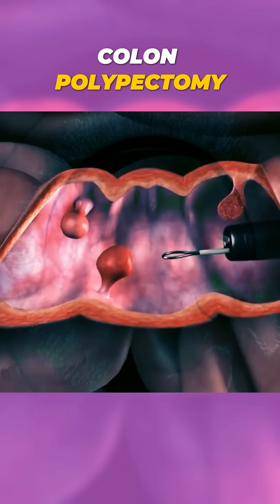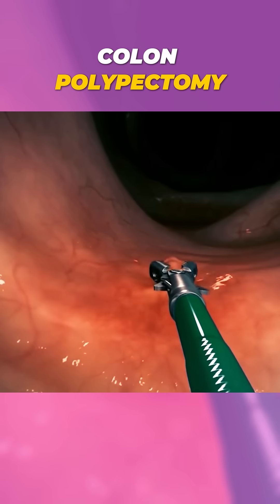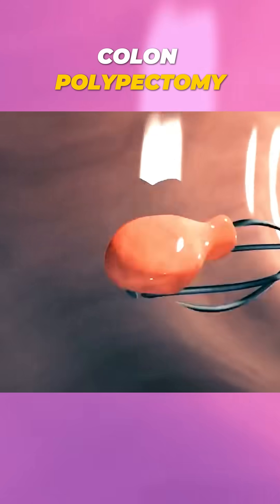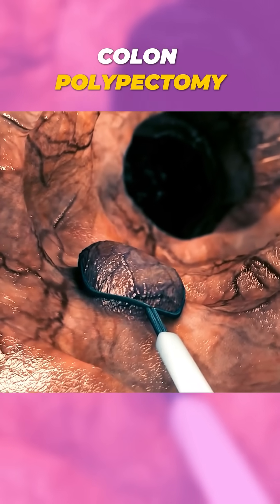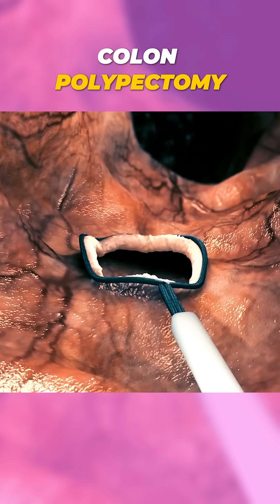If a polyp, or an abnormal growth, is detected, the doctor uses specialized instruments through the tube to carefully remove it. The polyp is then sent to a lab to check for cancerous cells. The entire process is usually quick and minimally invasive, with most patients heading home the same day.